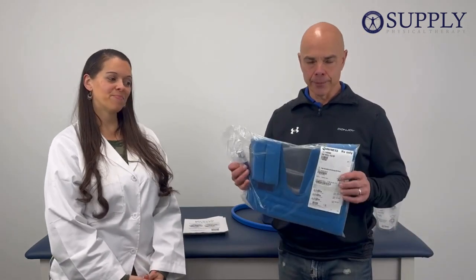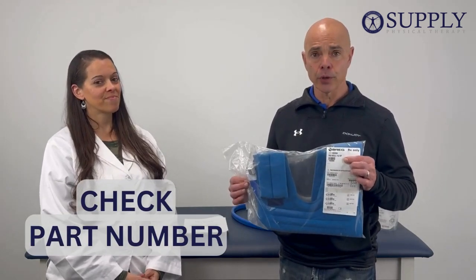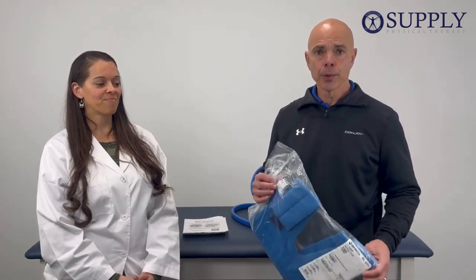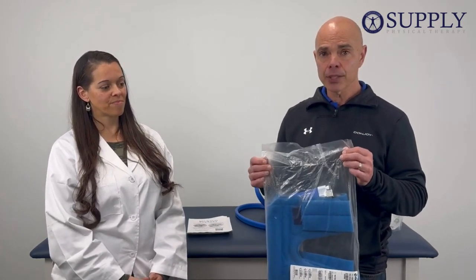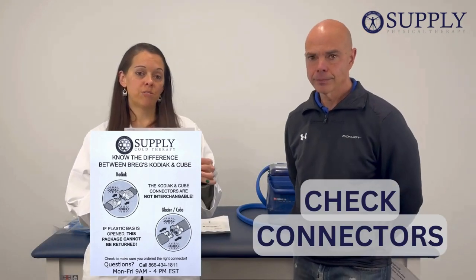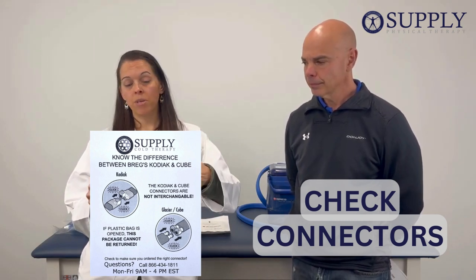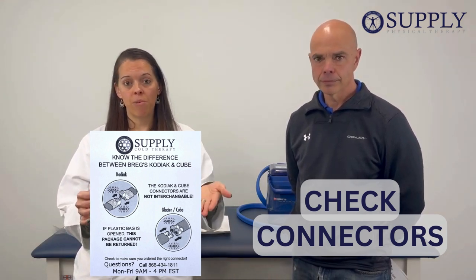When you get your pad in the mail, it's going to come in a sealed plastic bag. The first thing you want to do is check to make sure the part number is correct. The Bragg PolarCare Kodiak and Cube systems are not interchangeable, so these pads will not work on each of the systems. Notice this is a sealed bag — once this bag is opened, it cannot be returned, so please check to make sure you got the correct pad. Also with your pad, there's going to be a paper serving as a reminder to make sure you got the correct pad and showing you pictures that the connectors are different for the different pads.